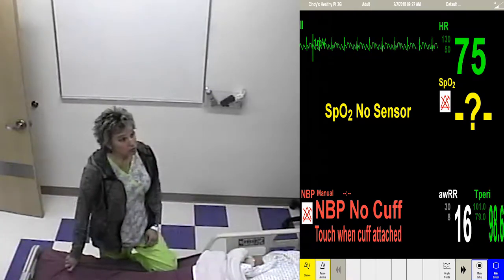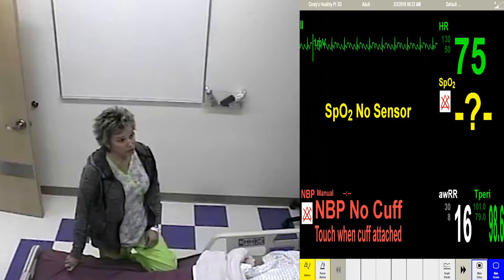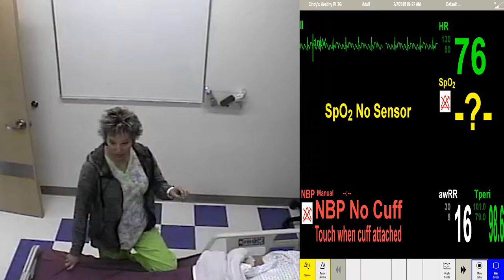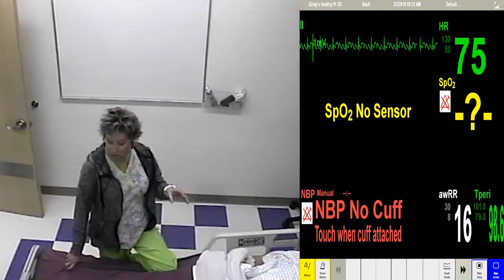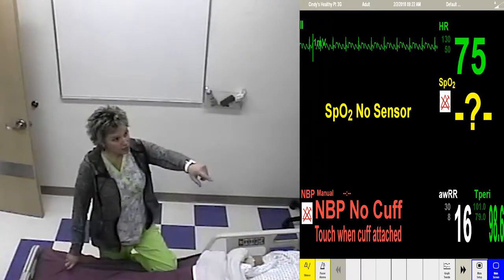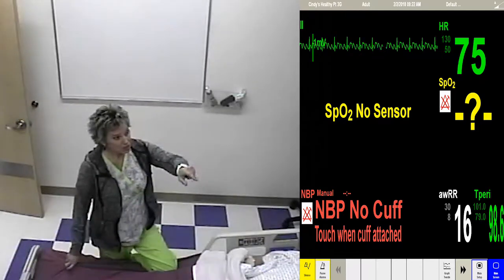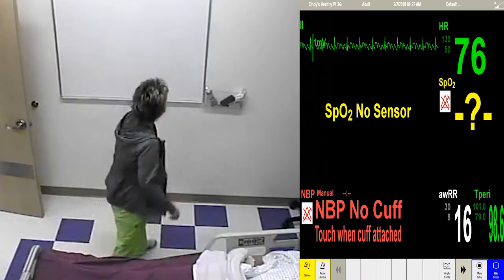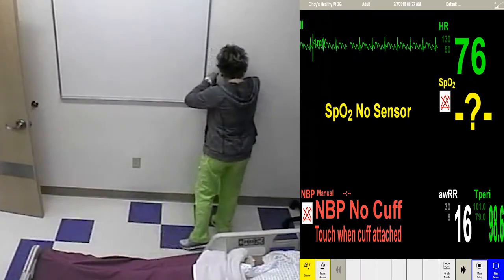No. So this one is called atrial flutter. You just need to really memorize this because it's the only one that looks this way. So you see the QRSs, right? And then you see the humps afterwards. Do you see how the humps are very uniform looking, pretty much? It's called a sawtooth pattern.